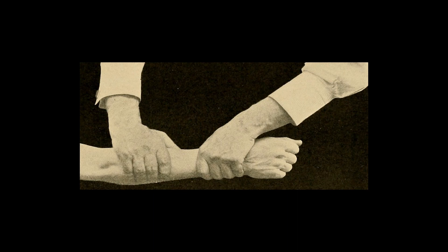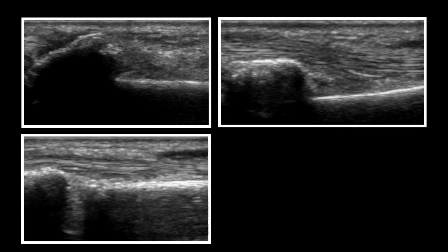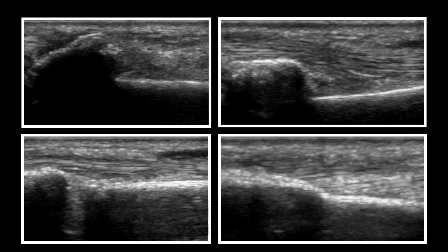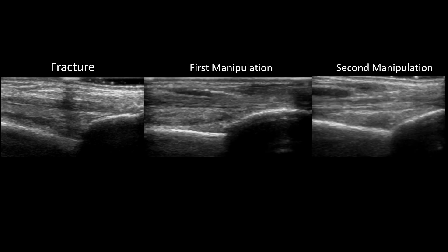Once you feel that there's been improvement, go ahead and place the probe back on the fracture site. In this first image we see the patient's fracture site. After initial manipulation there has been some improvement in the alignment but further work is required. The third image demonstrates further improvement, and in the fourth image we can see that the fracture site is back to anatomic alignment. Here is another example of a fracture with stepwise improvement during the manipulation until the fracture site is back to normal anatomic alignment.